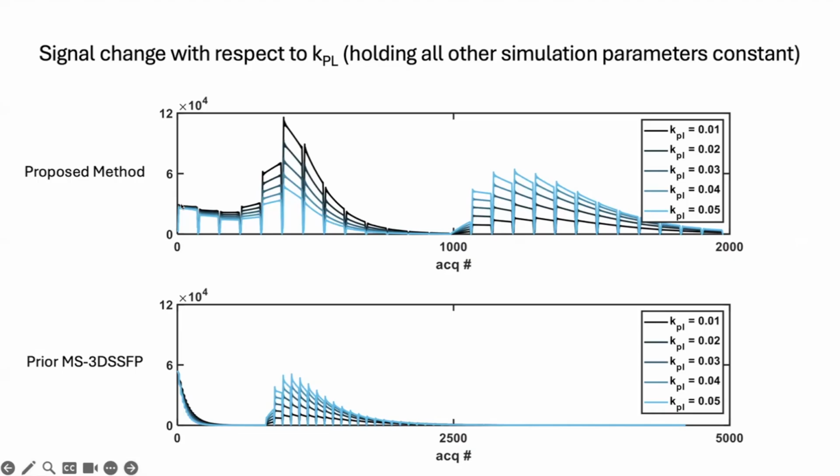So you can see the effect on the left here on pyruvate signal, where the initial low flip angles have a low, muted measured signal that ramps up after the first 15 seconds and then goes up to a relative peak. But all of this is modulated by our T1 of pyruvate. So even though we go from 8 degrees to 80 degrees flip angle, we only see maybe a 2 to 4-fold increase in relative pyruvate magnetization.